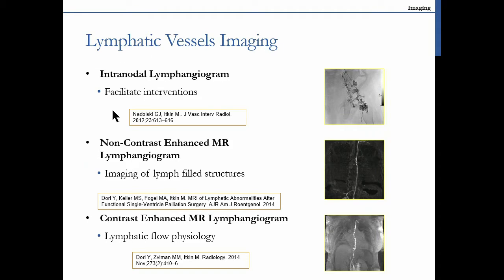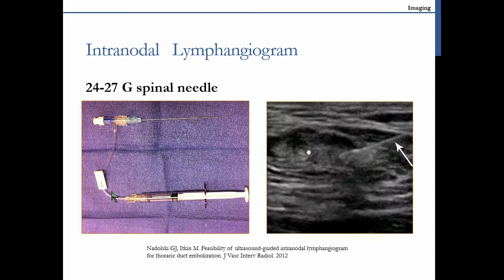First, intranodal lymphangiogram. We described it at approximately the same time as a group in Boston. There's non-contrast enhanced MR lymphangiogram that Dr. Roxon just talked about. We didn't discover or describe that. And there's a new technique that has become the main technique for us to diagnose lymphatic disorders, contrast enhanced MR lymphangiogram.